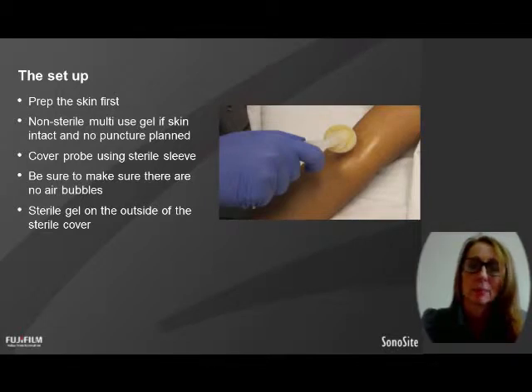We definitely should be cleaning between anyway. But I like to cover the probe whenever I'm using it on a patient. But if you're really not going to puncture the skin and you're really sure the skin's intact, then you could use the probe there and use a non-sterile multi-use gel. But if at all you're planning to puncture, or there's a skin break, or you're really not confident, or the patient has some sort of multi-resistant organism, I would prep it.